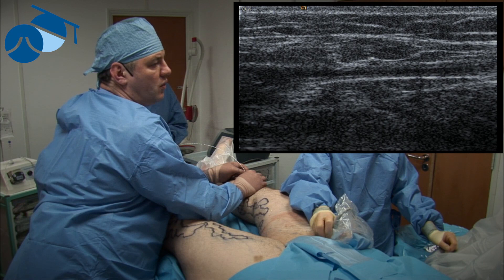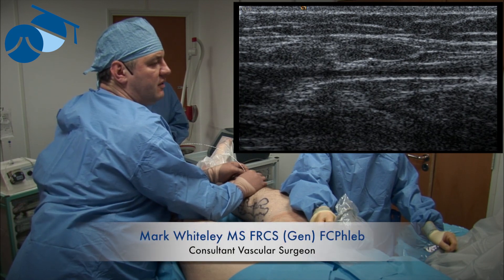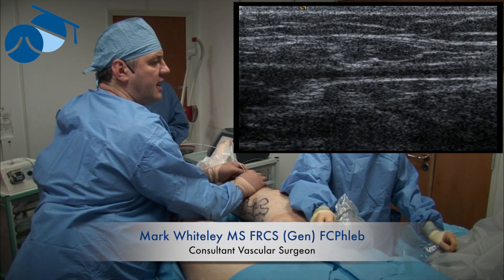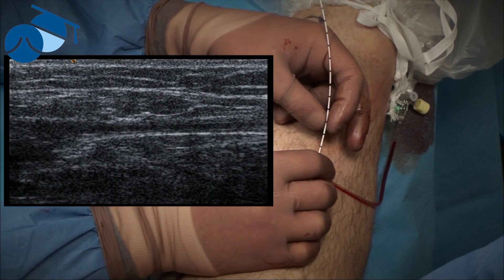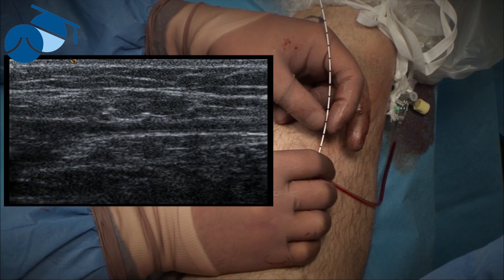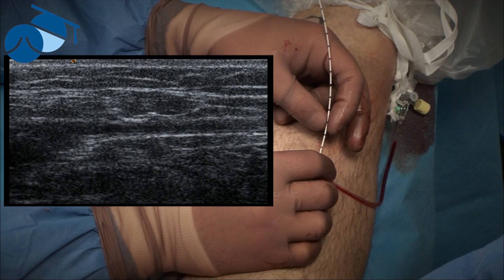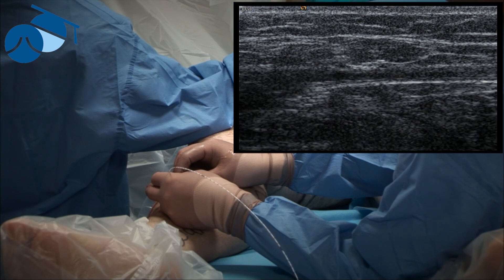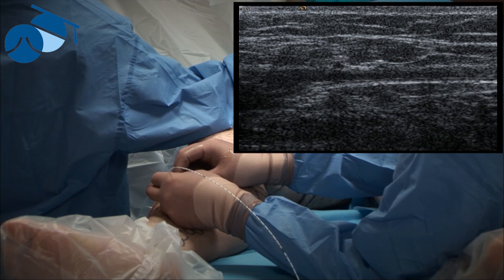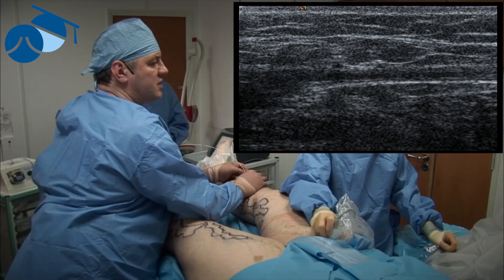Once the endovenous laser or thermoablation catheter is in the great saphenous vein, we get the vascular technologist to look at the sapheno-femoral junction in detail in longitudinal section. This is one of the reasons why it's essential to have two people doing this. In the past, surgeons or radiologists have tried to do it alone, but without control of the catheter throughout, you can misplace it or it can slip during the tumescence placing period.